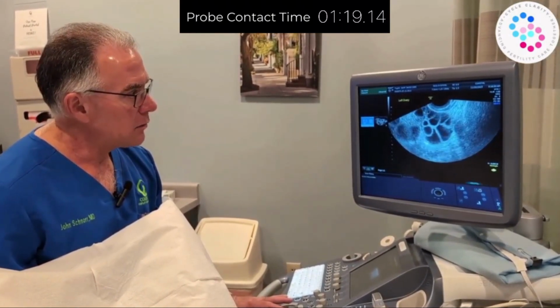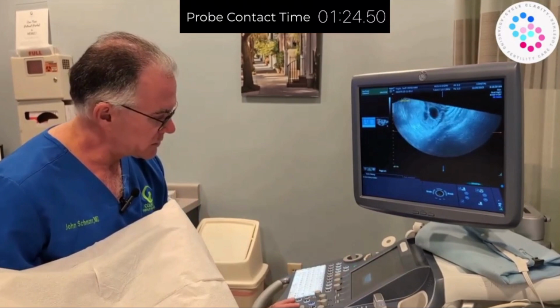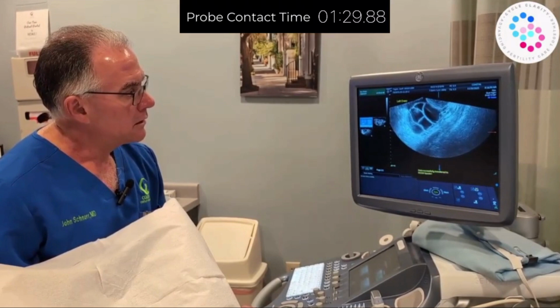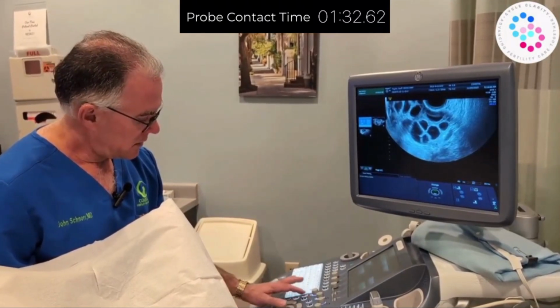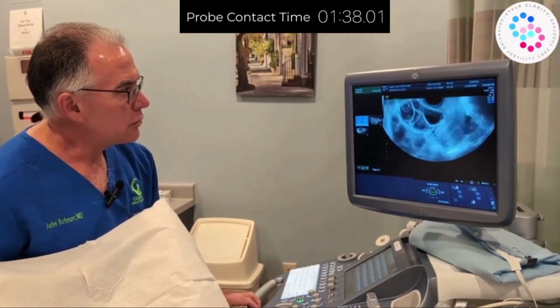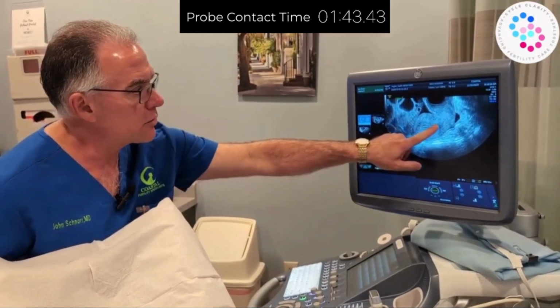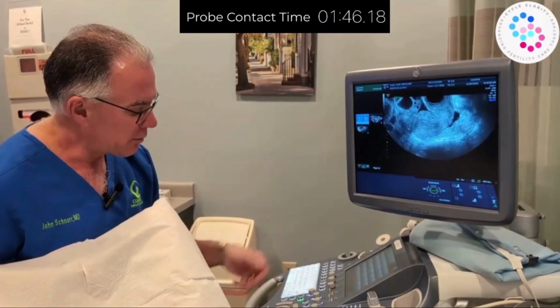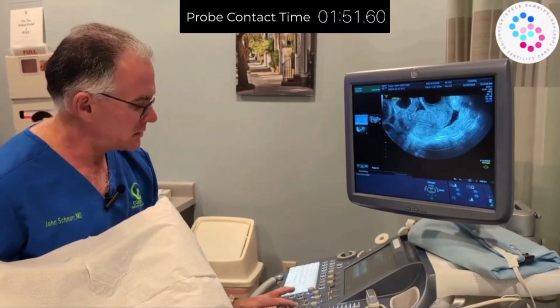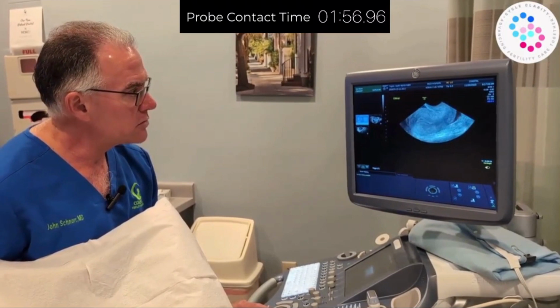And then the last thing that we do with these ultrasounds is we take a look at the uterus and see how the uterus is doing. Okay, we're going to label this uterus. And your uterus is right here in the center. The benefit of doing the uterine ultrasound is it gives us the ability to measure how the uterus is thickening on the inside. We think that's important for implantation. So we're going to get this all set for you so we can scan that. Okay, so the uterine ultrasound is now done.